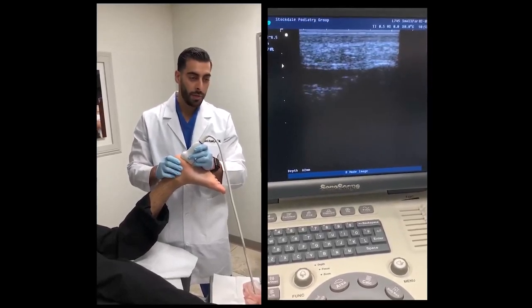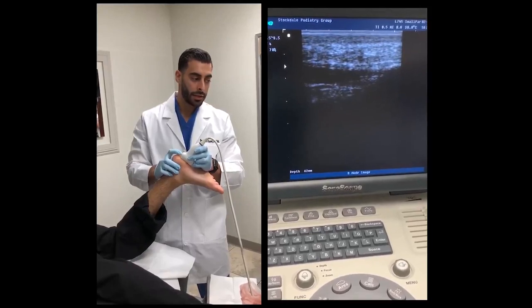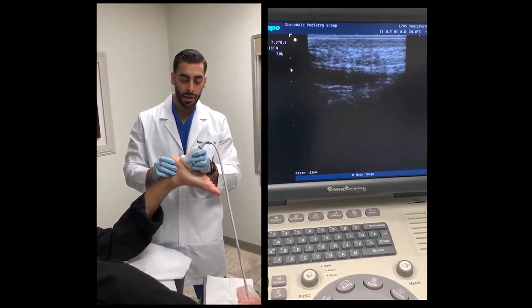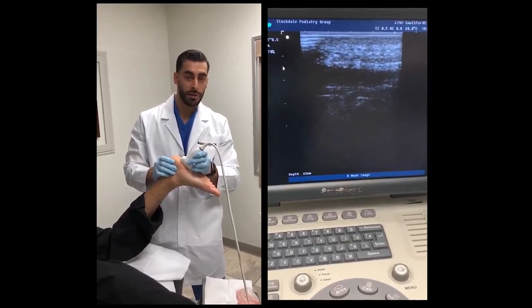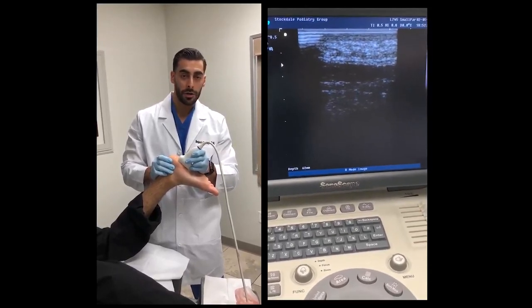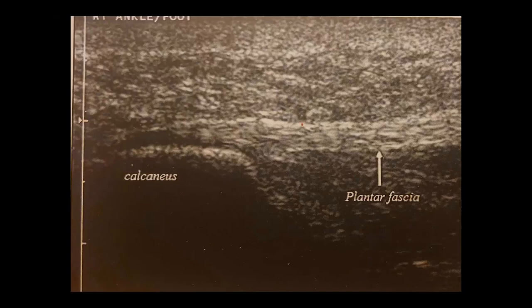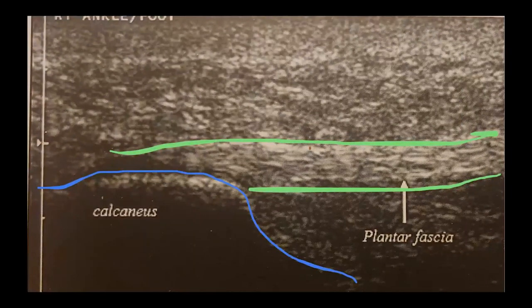You're going to see here a thin, hyperechoic band coming from the calcaneus, and the thickness of your band should be around 4 millimeters. That's what's considered normal — anything above that is considered thickened and abnormal, and you can say it's plantar fasciitis. The plantar fascia is seen as a hyperechoic band of tissue containing fine internal fibrillar architecture originating from the medial tubercle of the calcaneus.